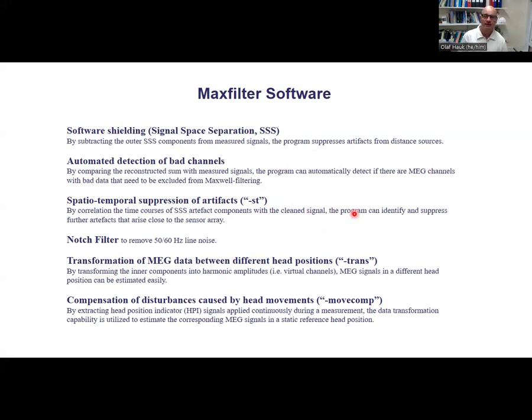Well, there might still be a temporal correlation of these outside components with the inside components. So you can check: if you take the outside components, they have a time course, like every component in this case. Just like with an ICA, for every component, you can look over time at how much this component contributes to your signal. So if these outside components still correlate above a certain degree with some of the inside components, you can conclude from that that they are still an artifact included in your data.